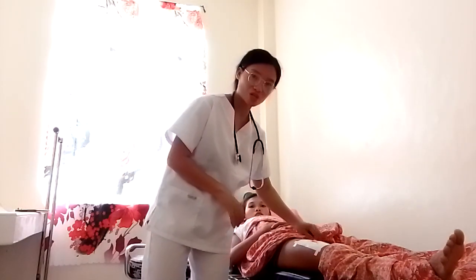Today we are going to do wound care. So what is wound care? Of course, from the word wound care, magdressing ta sa ato ang patient or magdressing ta o sasamad sa ato ang pasyente. So from wet to dry dressing.